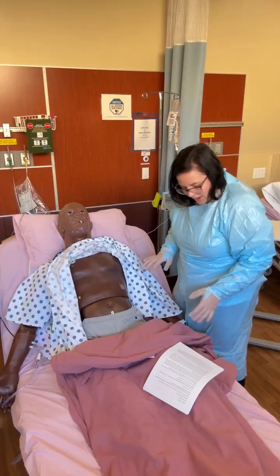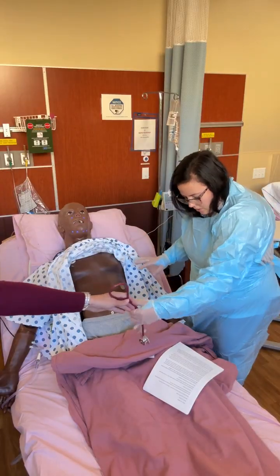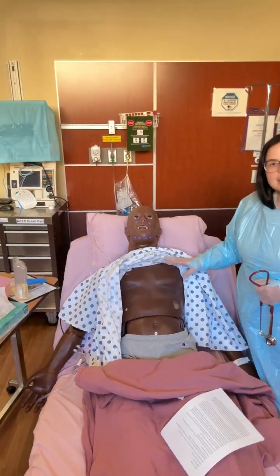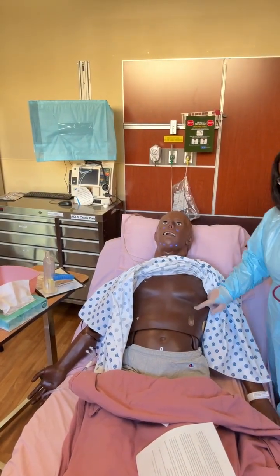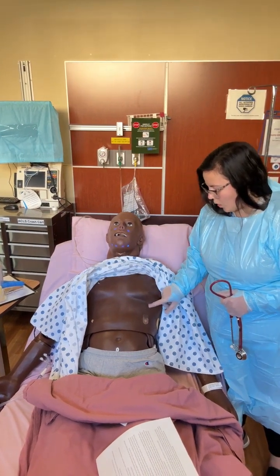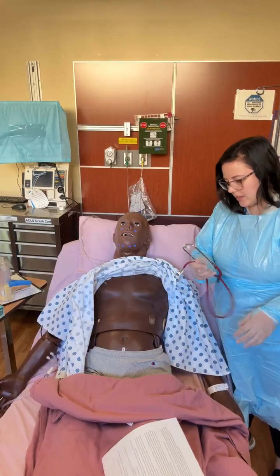And then we want you to go through all of your cardiac landmarks. So you're going to verbalize each location that you go to. Once you're ready to count the heart rate on the simulator, you're going to find this black X that's right here. That's where the speaker is that you can hear the best heart tones. So once you've gone through all your landmarks and you're ready to count, you're going to take your stethoscope.